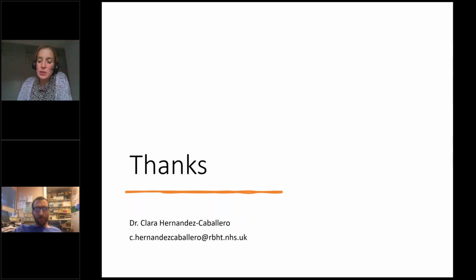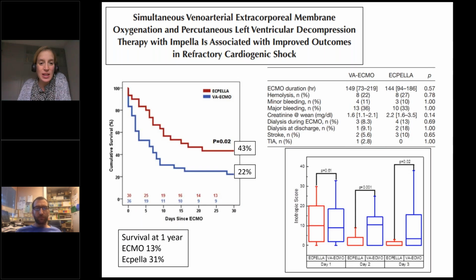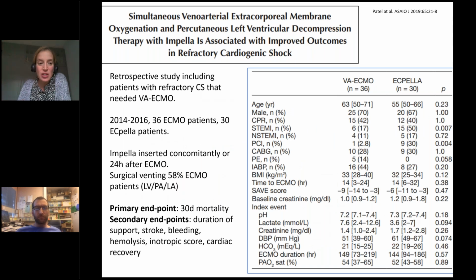Especially the American one, the last one, what they did is they put the patient on ECMO for cardiogenic shock, and then they waited. Some of them would develop LV distension slowly throughout the next 24 hours, and that's when they decided to go on ECPella. And some of the other patients had very poor LVs to start with, so they predicted that they would develop LV distension straight away, so they went for ECPella straight away. So there's a variability between the cases, but as I said, they didn't wait too long to go into ECPella, so less than 24 hours or around the 24-hour mark after going into ECMO, which probably explains the excellent results that they had with ECPella.